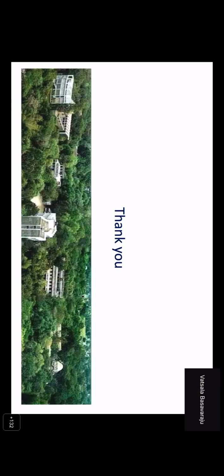What's the difference between Giemsa and modified Giemsa? Okay, it's about timings and the dilution of the stain. I'm not sure about the details, but you can email me and ask me. I can find out from the lab. But basically, modified Giemsa is what we recommend for H. pylori, not the regular Giemsa.